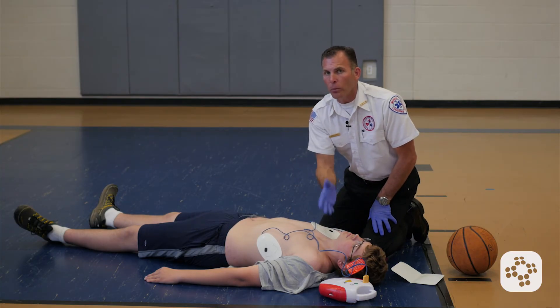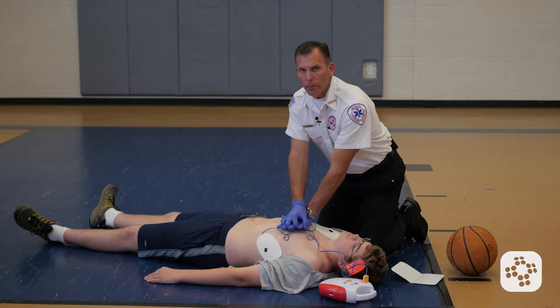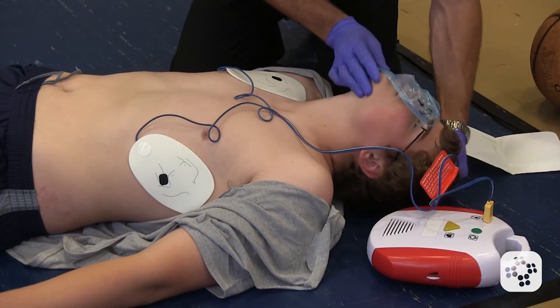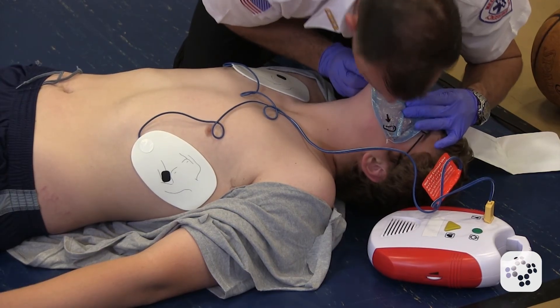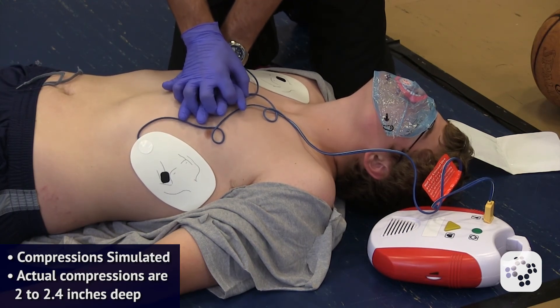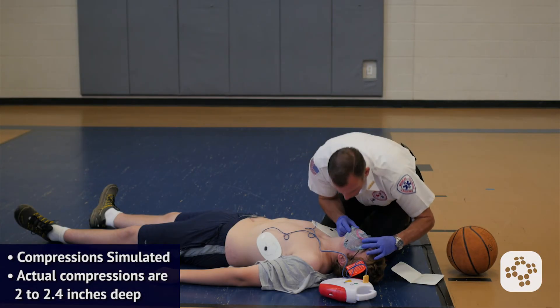We could follow the metronome, but it's not necessary. We know how to do these CPR compressions, so we're going to do the normal CPR. We're doing our 30 compressions. After the 30 compressions, just like before, we do the head tilt, chin lift, and we give two rescue breaths. Going right back into the chest compressions, completing the count through 30, followed by two more breaths.